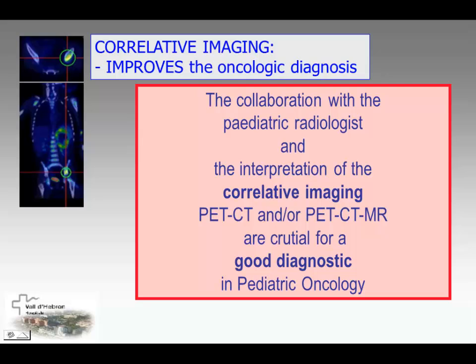Thank you for your comment. I was wondering, you told us about a neuroblastoma case, although we all know that it has modest specificity in neuroblastoma, in which iodine-123 MIBG may be preferable. Do you have any preference for PET-CT in neuroblastoma?